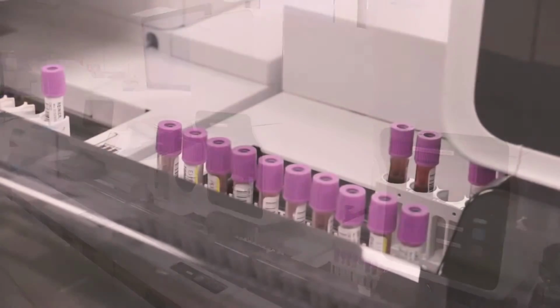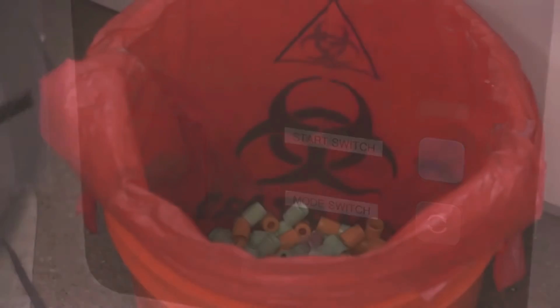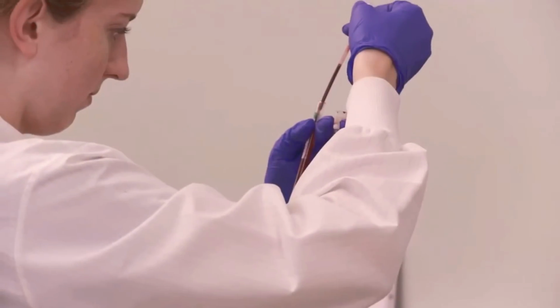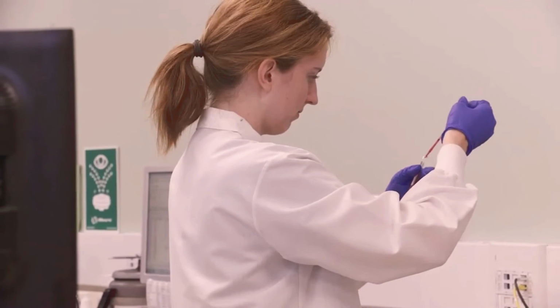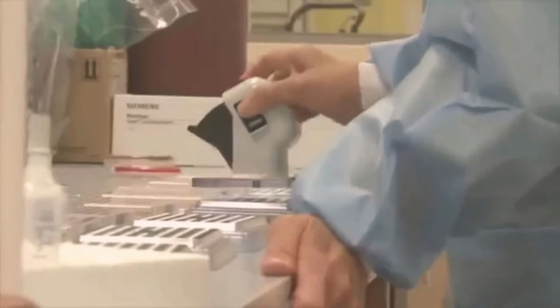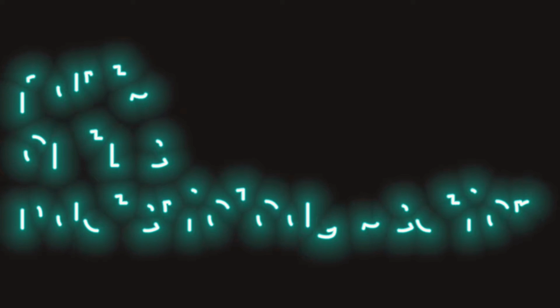The laboratory where specimens are received and sorted once they arrive or are delivered. After organizing all the specimens, they are now prepared for processing. Samples from patients suspected of bacterial infections undergo several tests which occur at the bacteriology section.